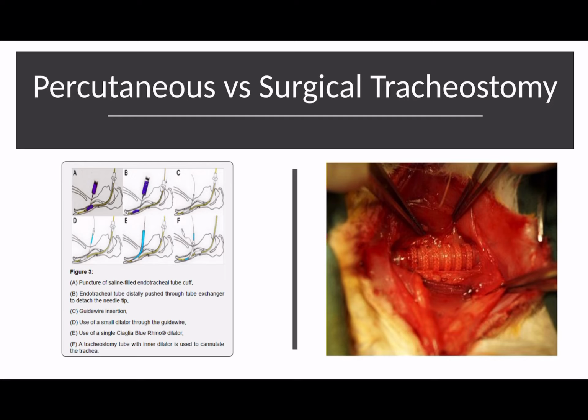And if that is the case, if they haven't had a laryngectomy, which for percutaneous tracheostomies they wouldn't have, then always intubate from the top if you need to, and if you can't easily get back into that tract.